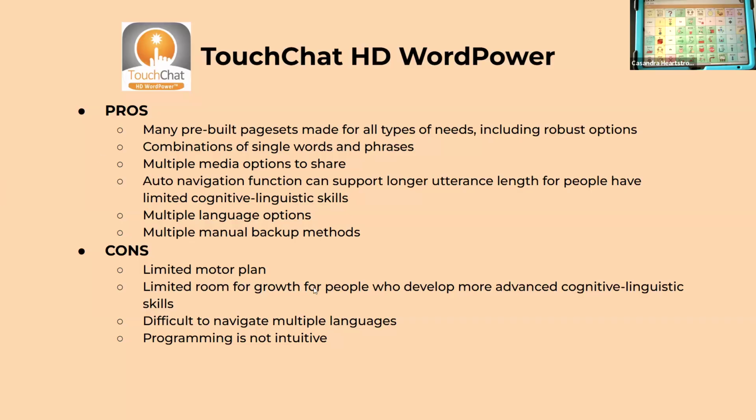It's got limited growth for people who develop more advanced cognitive linguistic skills because it's always going to auto advance for you. It's going to take you to a page and auto advance for you, which again is great for somebody who's just learning language, but once they have learned it, it can be a barrier. It's like when you're trying to text something and you send it and didn't realize that autocorrect put in a whole different word for you. Similarly, Touch Chat with Word Power will autocorrect you, maybe in a way that you don't want to go.